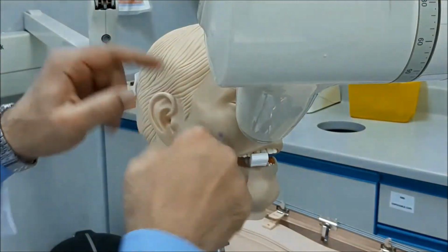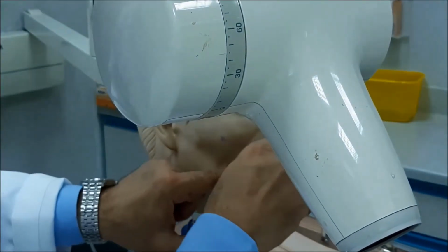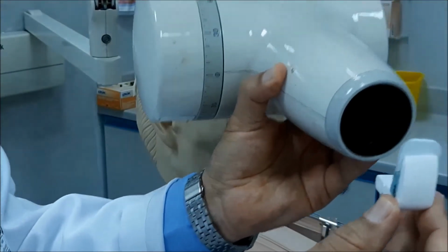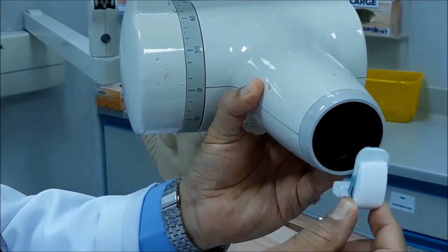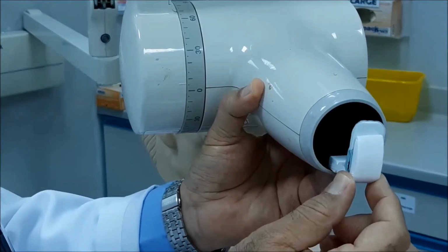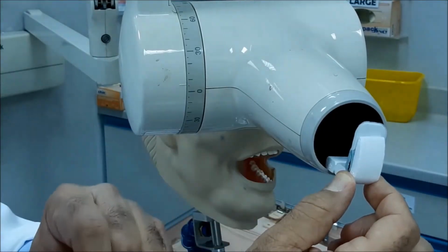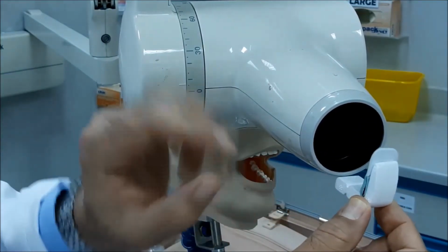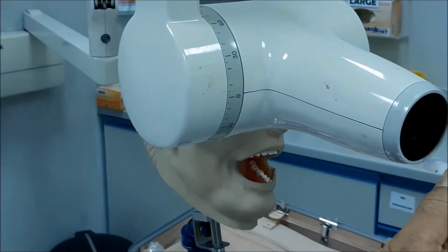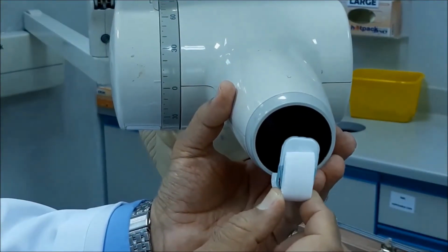Make sure that the cone completely covers the film or the sensor in this relationship. This is cone cut. So make sure that the lower border of the bite is within the cone, or you can even extend it down so that you will have a flush margin over here, so you will not end up with cone cut. If you guarantee this relationship, you will not have cone cut whatsoever.